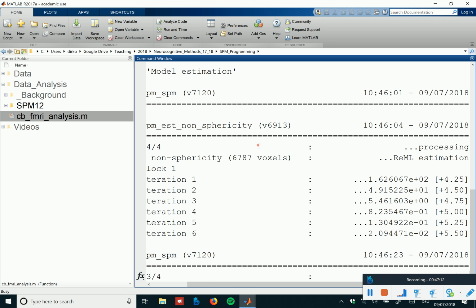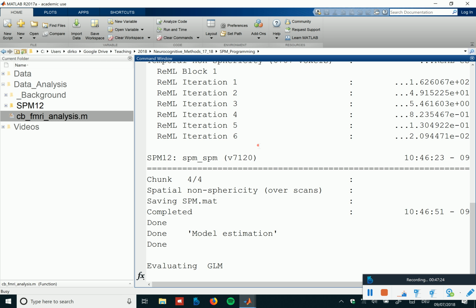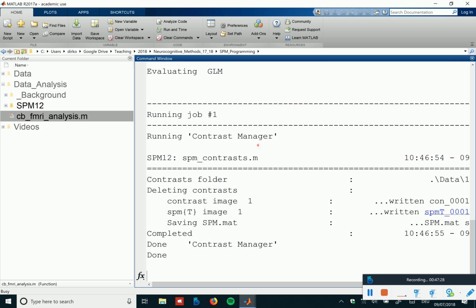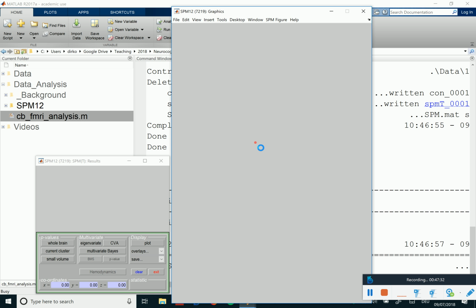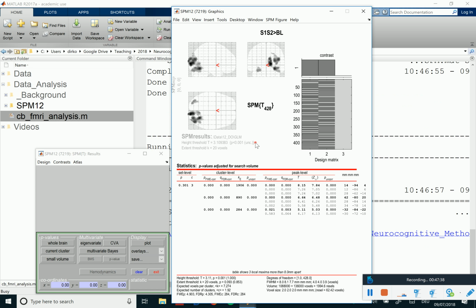And then the second level analysis takes the con images for single participant parameters to the second level, as they say. So one basically evaluates a beta parameter estimate for each voxel for each participant. And then if one has 12 participants, one has 12 values for each voxel, which correspond to beta estimates on the first level, and does a one sample t-test over them.